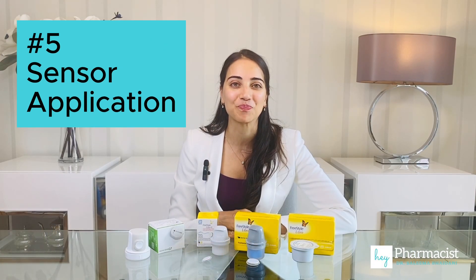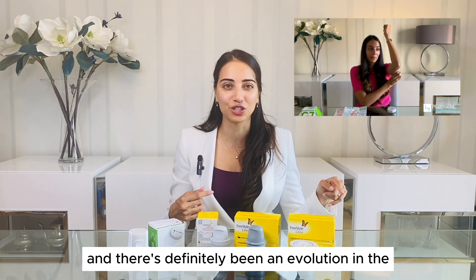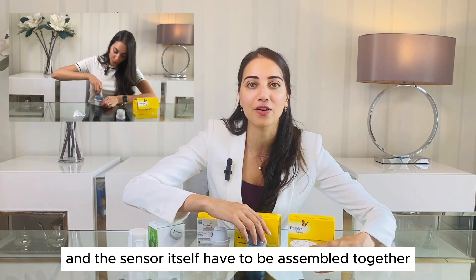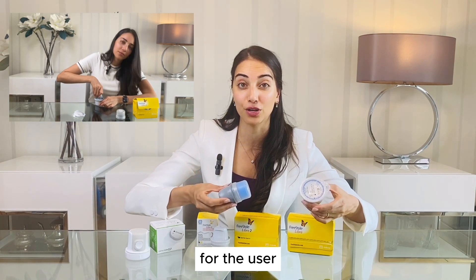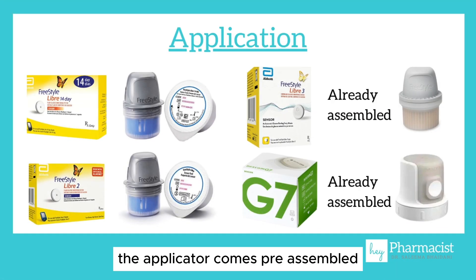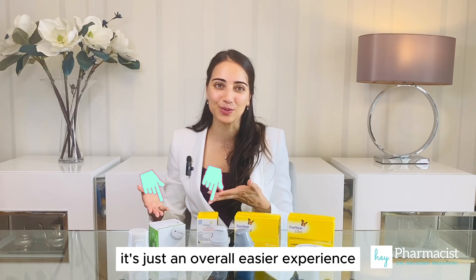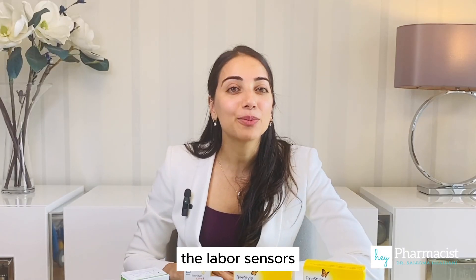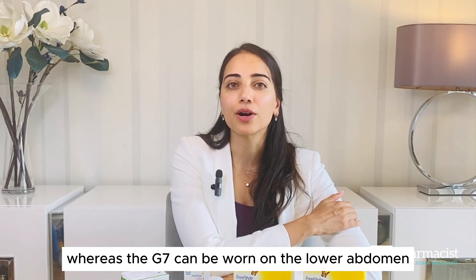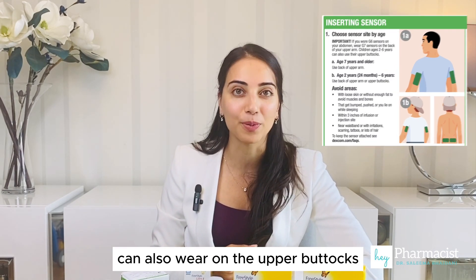Next up, application. I've done demos on all four of these devices, and there's definitely been an evolution in the application of the Libre. For the Libre 1 and 2, the sensor applicator and the sensor itself have to be assembled together. For the Libre 3 and the Dexcom G7, the applicator comes pre-assembled, hence why the boxes are so much shorter — it's just an overall easier experience with these two. The Libre sensors are only approved to be worn on the back of the arm, whereas the G7 can be worn on the lower abdomen, and kids from age 2 to 6 can also wear it on the upper buttocks.